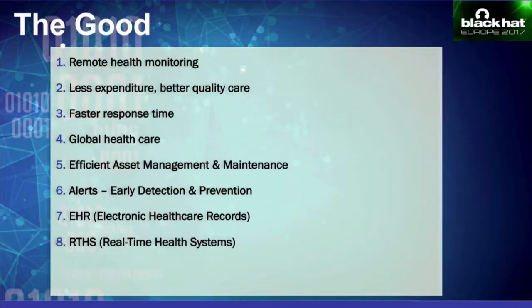When it comes to asset management, since most of these devices connect to a central system, it becomes very easy to maintain these devices, troubleshoot these devices, update these devices. You can monitor signs of malfunctioning at an early stage and fix those devices. Then there are alerts. A connected medical device could alert a patient if there's a deviation from normality. For example, again, if the insulin level drops, it can alert a patient or inject insulin into the body, allowing the patient time to contact the first responders, and so on.